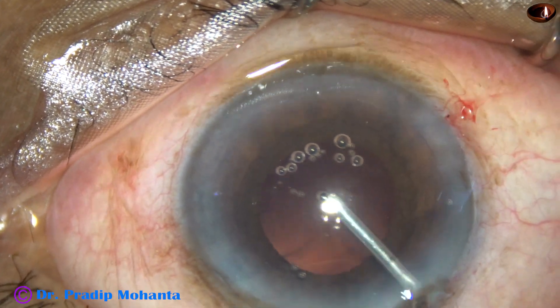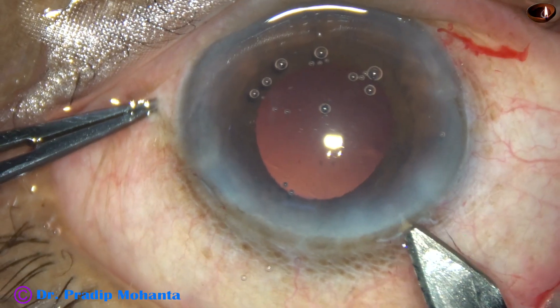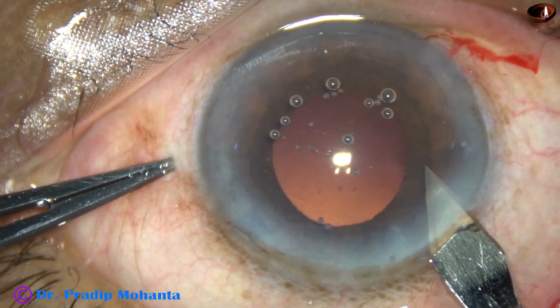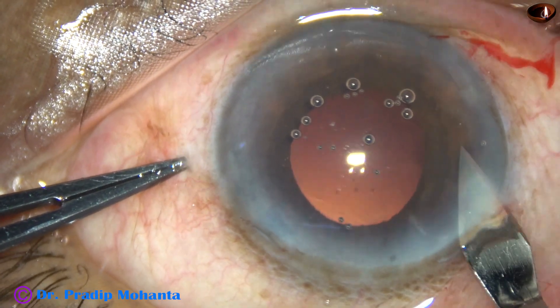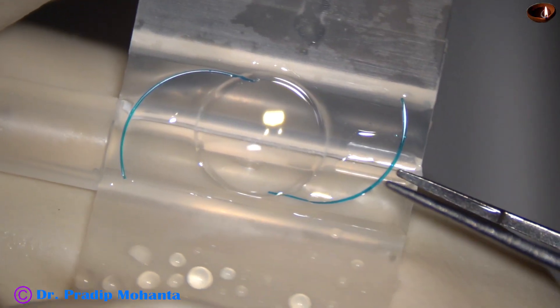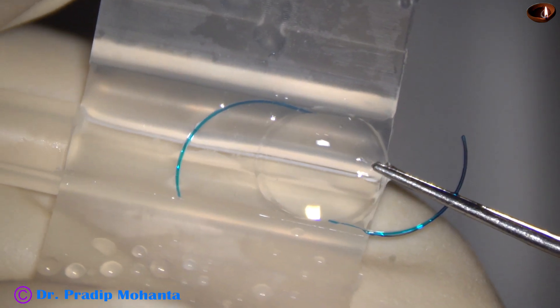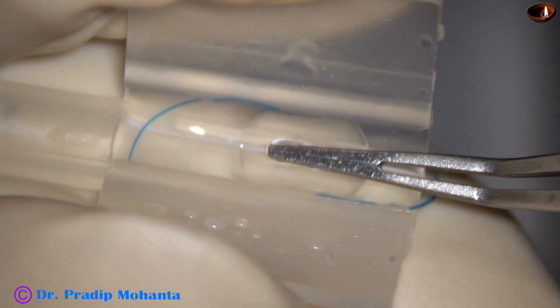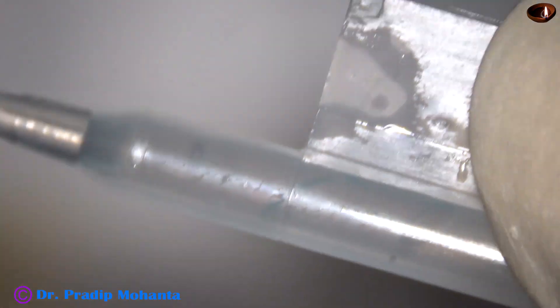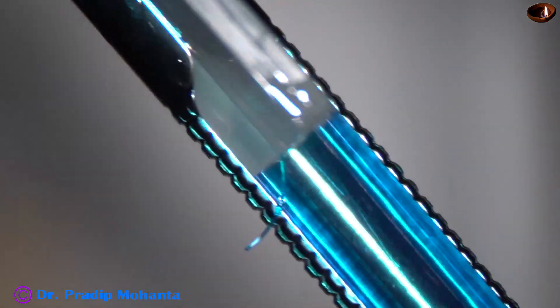In this case we have selected a multipiece intraocular lens, and for that we need to enlarge the main wound a bit. The right end of the main incision is enlarged. The optic of the Sensar multipiece intraocular lens is placed behind the cantilevers of the cartridge. The optic is folded and the haptics must be in the lumen of the cartridge. The cartridge is then placed in the injector.